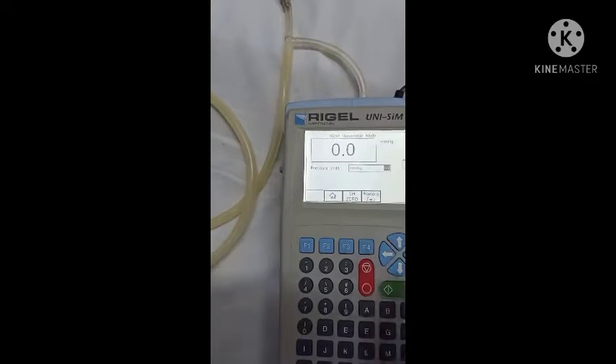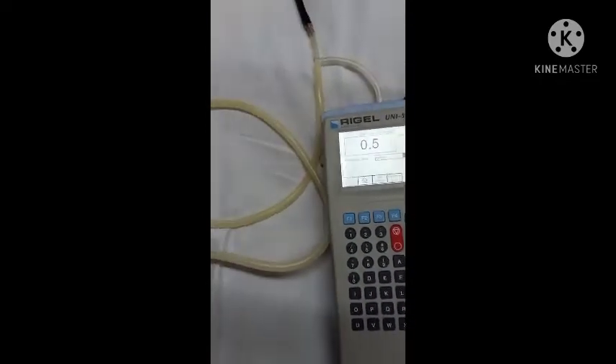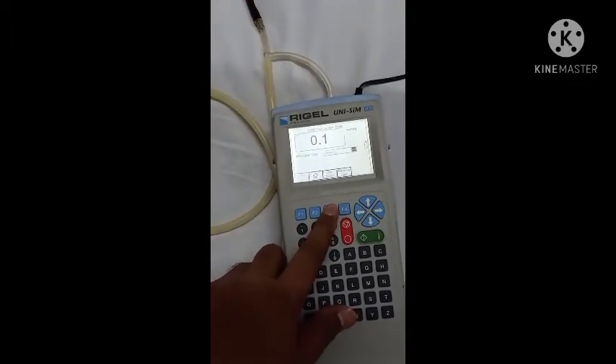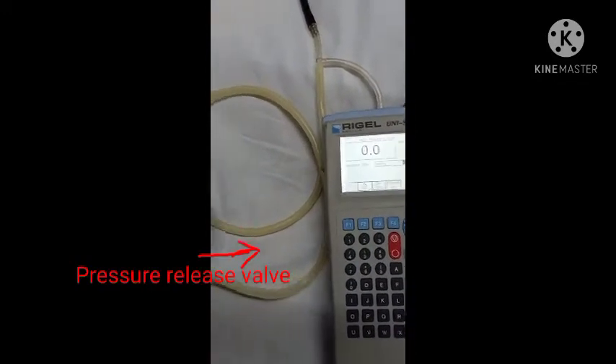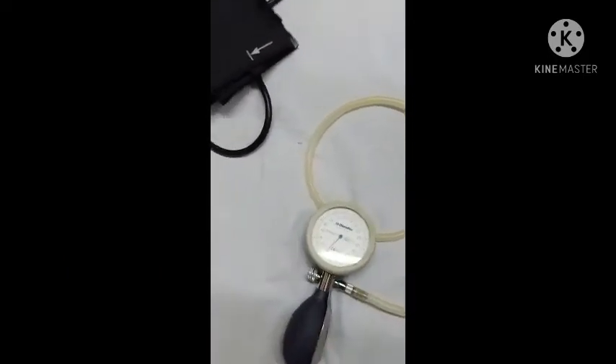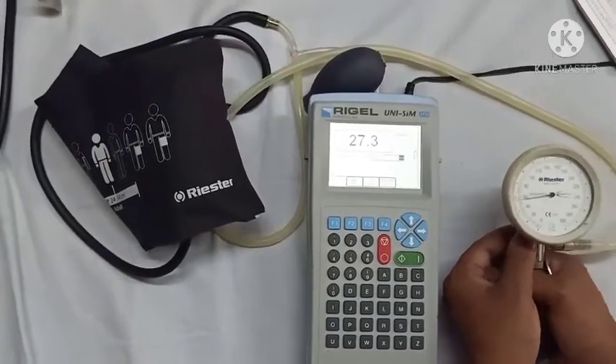Now you can see the display is showing 0.0 mmHg. You can change the unit by using the right and left keys. If the display is not showing zero, we can get zero by pressing the F3 key. Before starting the calibration, we will tighten the pressure release valve so that air cannot leak through the valve.